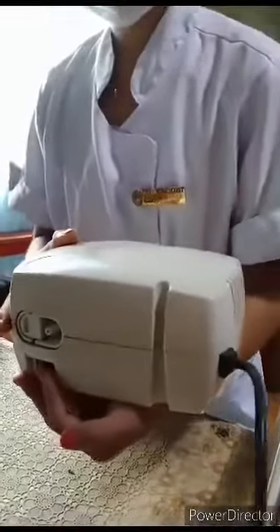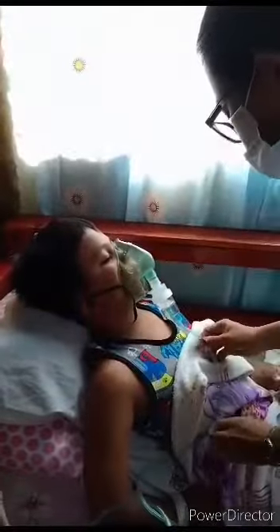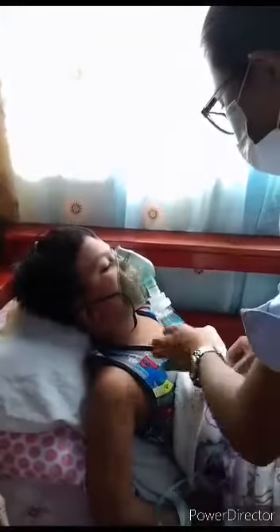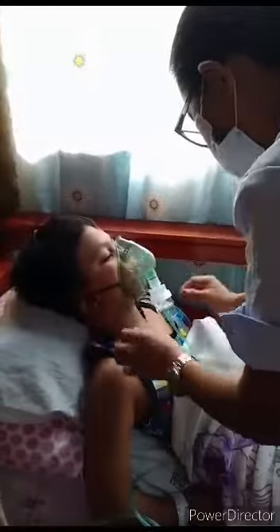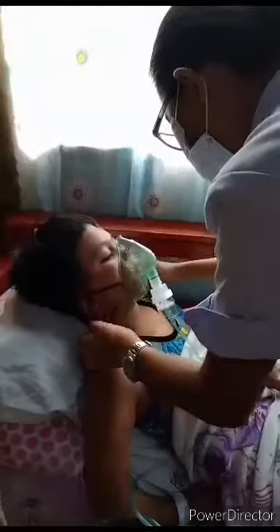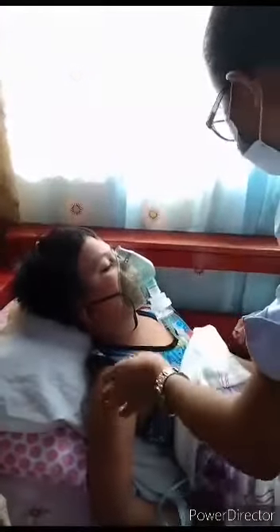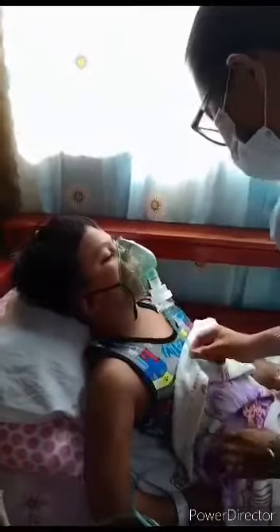Step number 8. Turn on the air compressor to ensure the efficient vaporization of the medication. Step number 9. Observe the fine spray from the nebulizer to check that the equipment is working. Step number 10. Encourage the patient to breathe the nebulized vapor through the mouthpiece. A mask may be used if a patient has difficulty with the mouthpiece. Breathing through the mouth, or normally with a mask, helps the medication travel to the lungs for maximum effect.